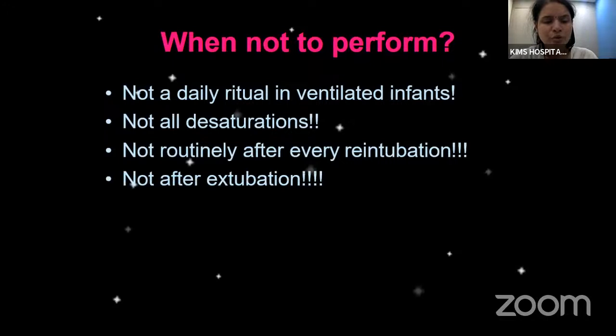Very important to also know when not to perform regular X-rays. An X-ray is definitely not to be performed as a daily ritual in a ventilated infant. So in every ventilated infant, provided the baby is clinically getting better or ventilatory requirement is getting better, it is not a daily ritual to repeat an X-ray. Also, X-ray need not be done for every dip in saturation. However, if there are persistent dips in saturation or repeated episodes of desaturation that necessitate increase in respiratory support, then a repeat X-ray is often useful.